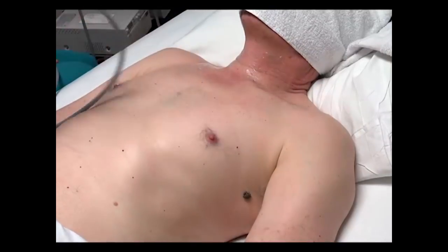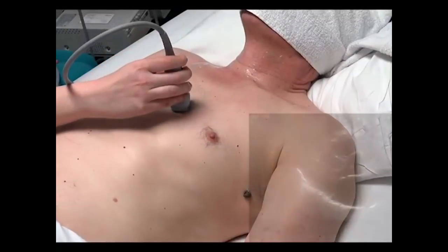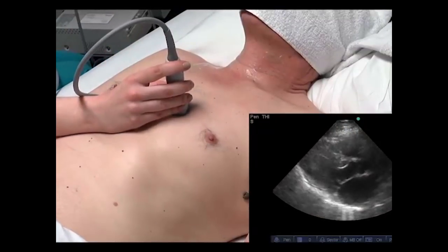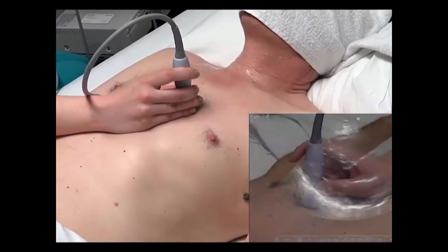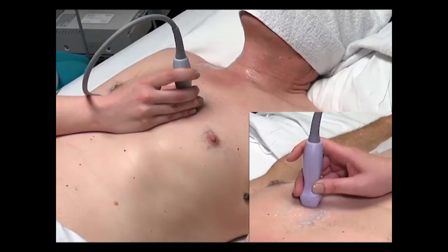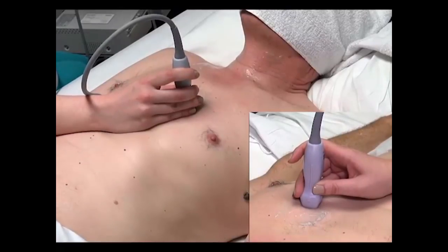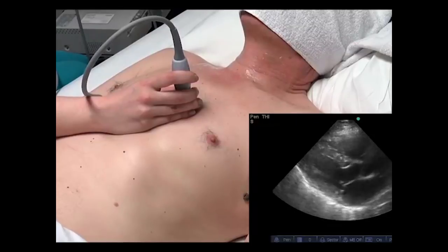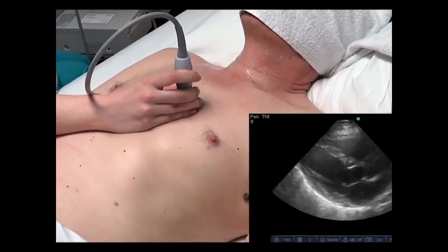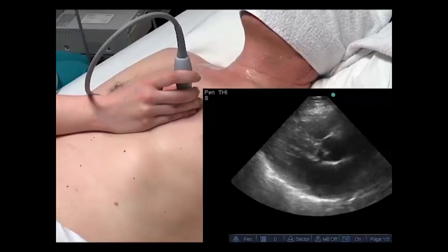Let's discuss goal-directed echocardiography and how to obtain the full goal-directed examination image set. The examination starts by placing the probe in the parasternal position. The indicator on the probe would be pointed in general towards the patient's right shoulder. Then with small movements, angling and tilting, and even moving the probe a little bit, the parasternal long axis view of the heart is obtained.